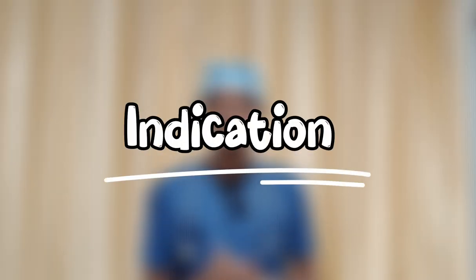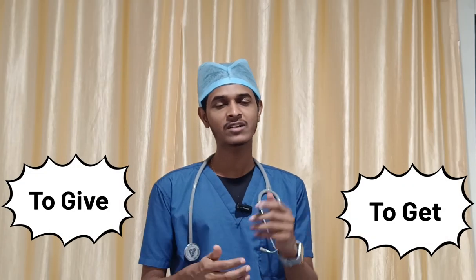Then, for what purpose are we inserting it, or what is the indication? In one statement I can say: to give and then to get. To give means if the person is unable to take anything orally, we can administer some feedings, or through the Ryles tube we can administer some medications. That is, in a simple way, to give.